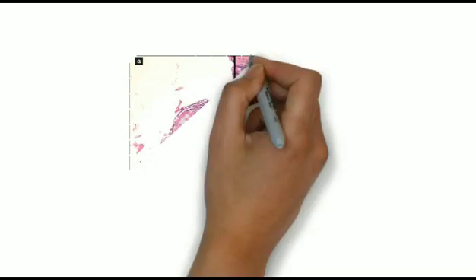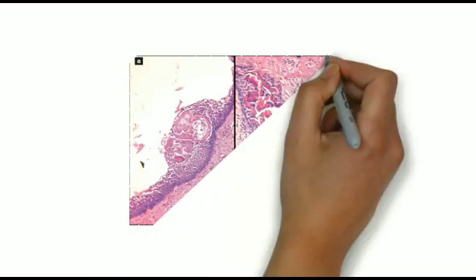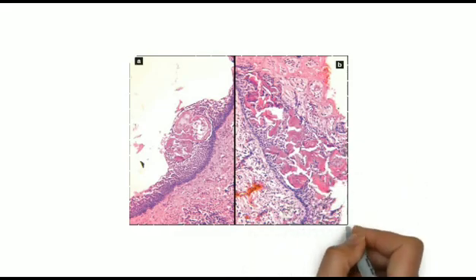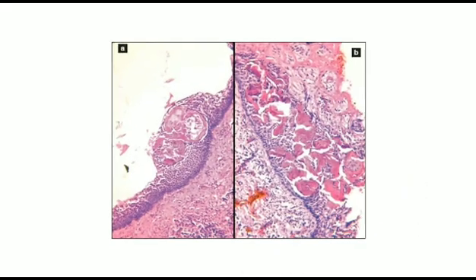The cyst lumen may be filled with fluid and cellular debris. On occasion, the lining epithelium may demonstrate linear or arch-shaped calcifications known as Rushton bodies.